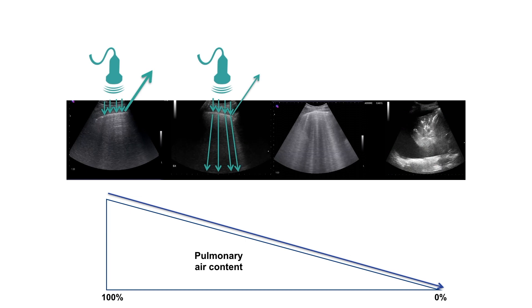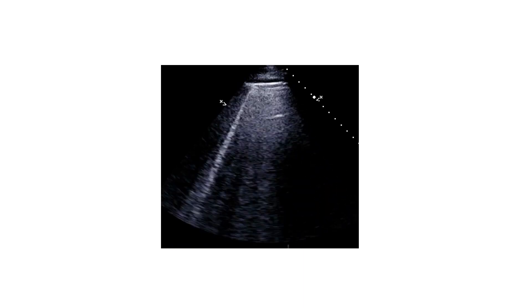And what we visualize are the B-Lines, which are hyperechoic, vertical lines arising from the pleural line, moving synchronously with respiration — in case there is sliding — and extending to the bottom or almost to the bottom of the screen.